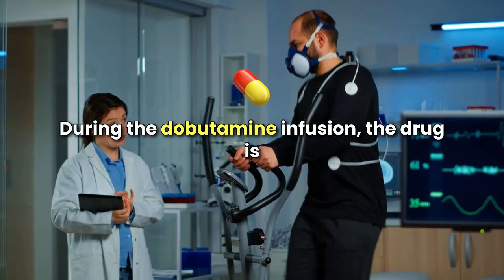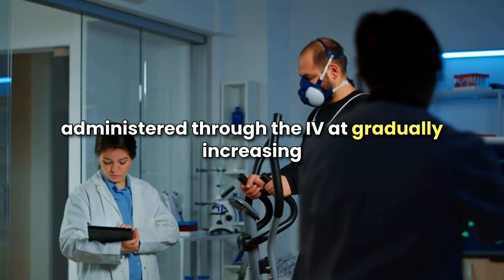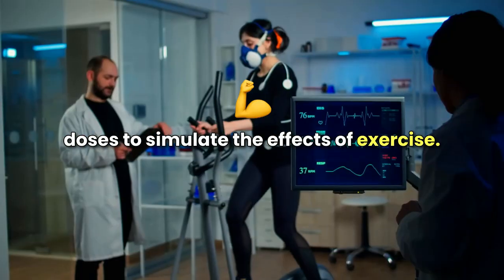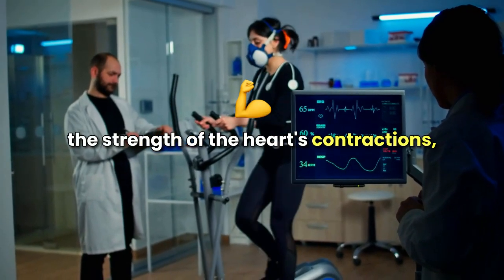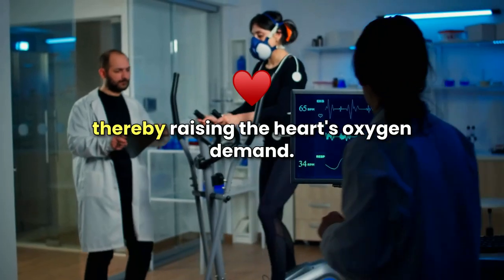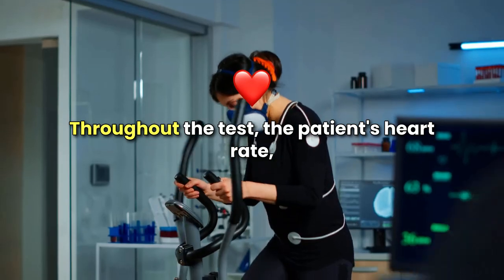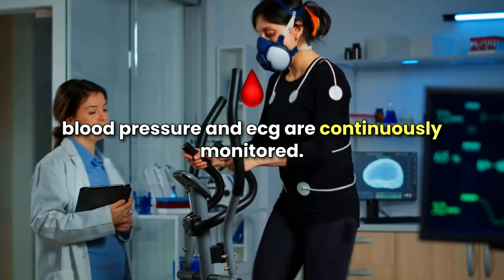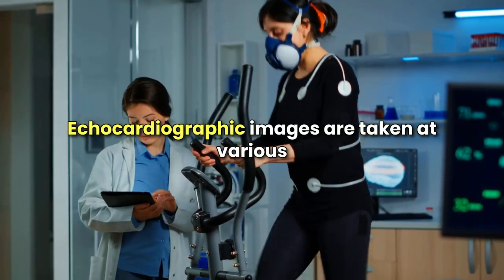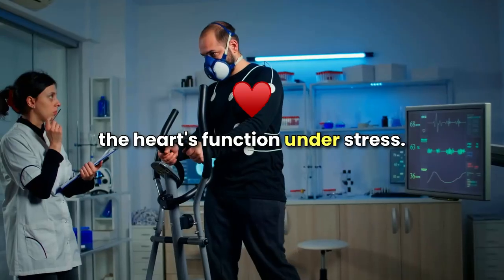During the dobutamine infusion, the drug is administered through the IV at gradually increasing doses to simulate the effects of exercise. This increases the heart rate and the strength of the heart's contractions, thereby raising the heart's oxygen demand. Throughout the test, the patient's heart rate, blood pressure, and ECG are continuously monitored. Echocardiographic images are taken at various stages of the infusion to assess the heart's function under stress.